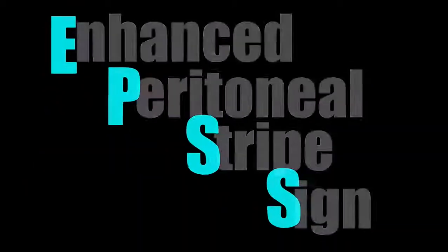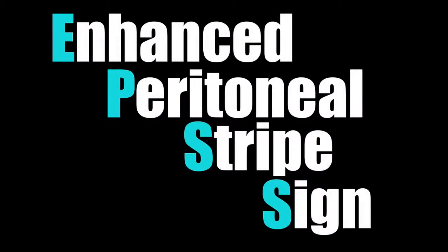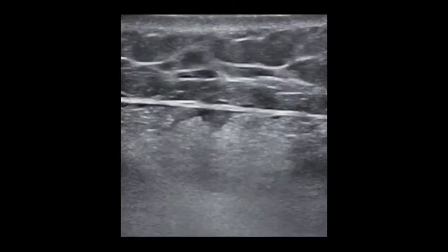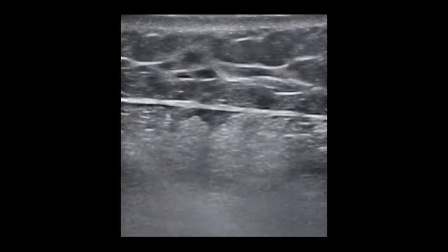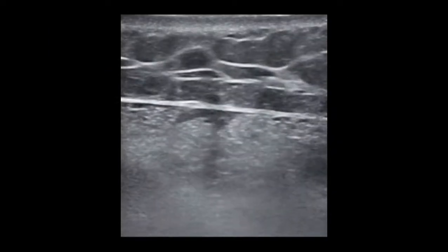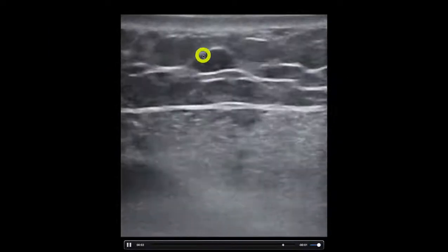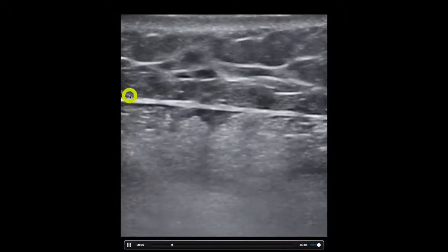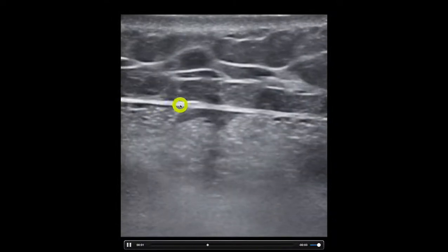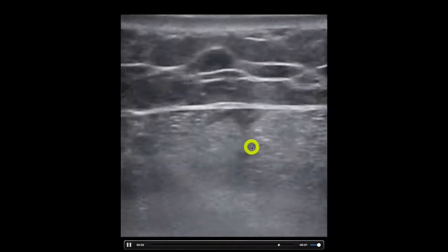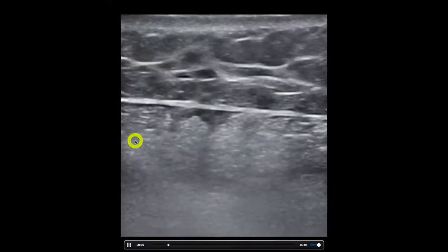This examination is all about the EPSS — not the heart EPSS or E-point septal separation. We are going to talk about the enhanced peritoneal stripe sign. This is a non-enhanced peritoneal stripe. This is some subcutaneous tissue over here, this is the peritoneal lining, and then we have a bunch of bowel underneath it.